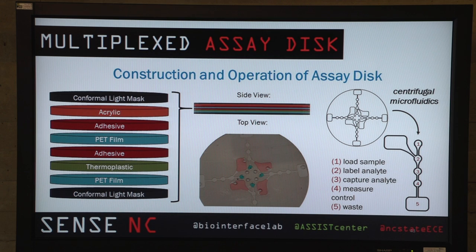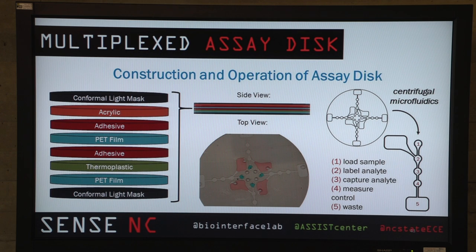Once it's all flowed through, the control strip lights up and the sample is measured in well number three. Looking at the disk from the top, the red wells contain the integrated wash buffer and the green wells are where we load the sample in. The disk itself is constructed of various materials: two light masking layers on the top and bottom, with channels etched into the acrylic. The rest of the layers ensure the microfluidic channel is sealed and that flow proceeds along the channels and not outward through the device.